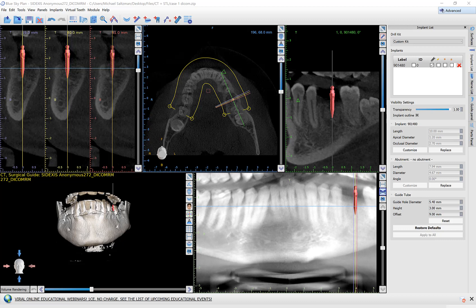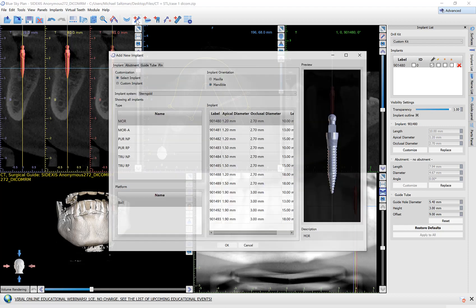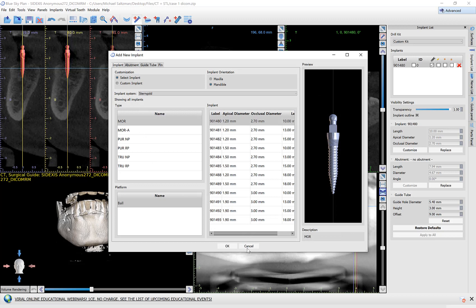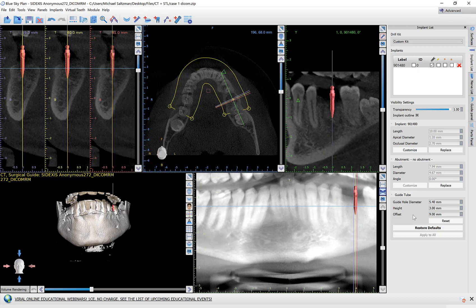But if you are using such a system, what you could do is select an implant from another company that has the same dimensions, place that implant, and then customize the settings to work with the surgical kit of the company that you have. The software will save that information, and every time you place implants from that fictitious company, you'll have the settings saved and remembered. I hope this provided some clarification — if anybody has any questions, post below or contact us at alwaysplan.blueskybio.com.